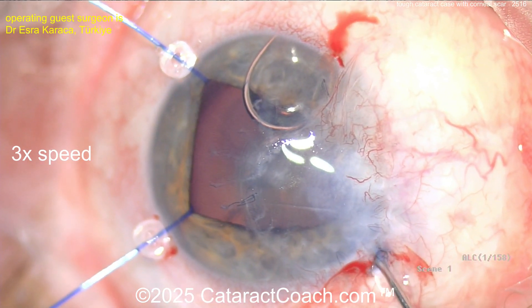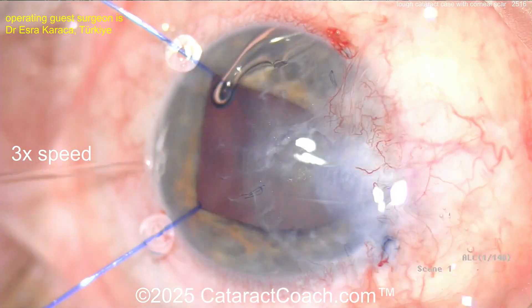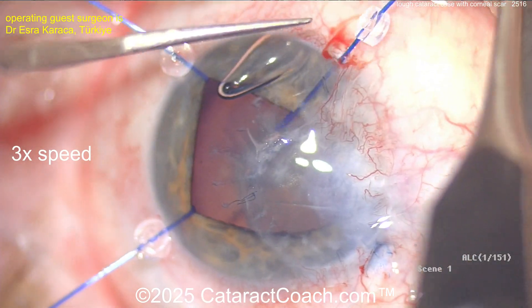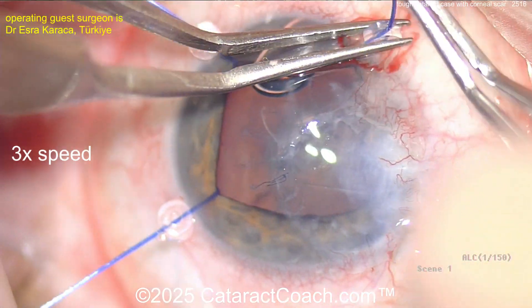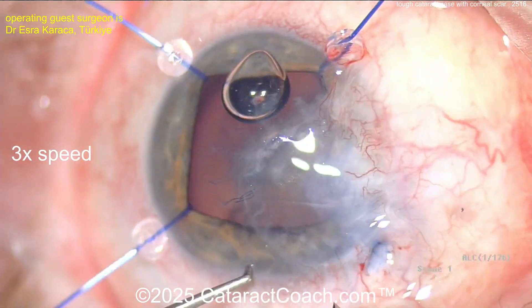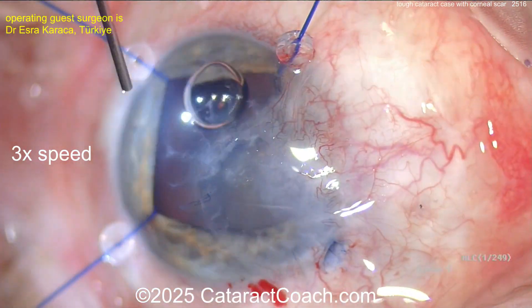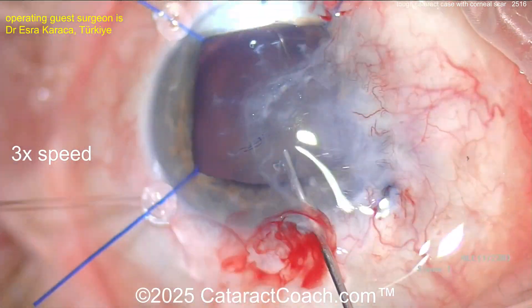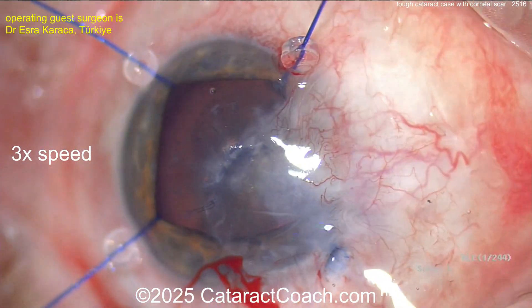Here's another paracentesis going in, and another iris hook. Now you've got good exposure and you can see the patient has a central cataract that needs to be removed. How would you do lens calculations in an eye like this? There's the main incision — I tend to want to make that away from all this scarred area.